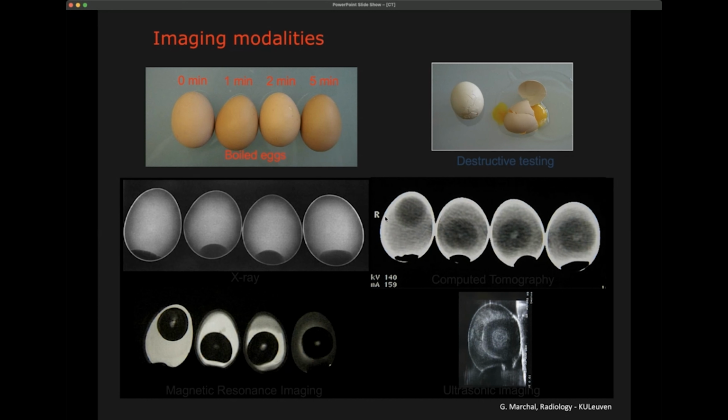And that is by the principle of X-ray imaging, as we explained before, where what we do is we try to measure the interaction of X-rays with the atoms. So we really look at atomic concentrations, and we want to have X-ray absorption, which is predominantly by ionization, where electrons are being kicked away from atoms as soon as the energy of the photon is big enough.